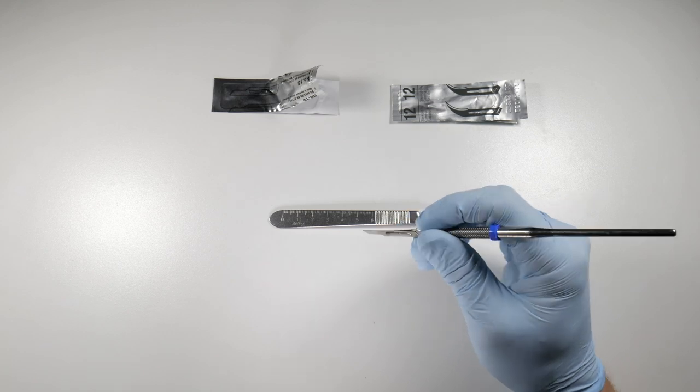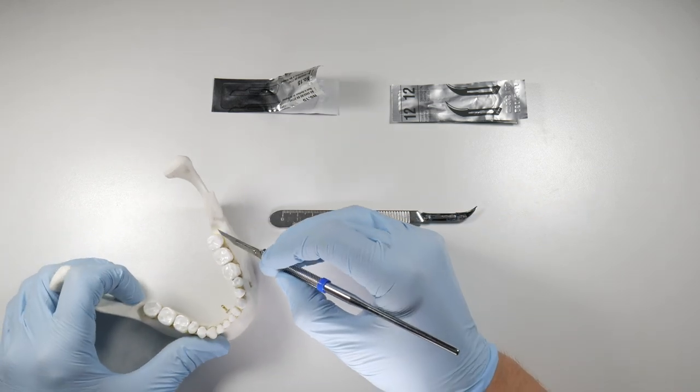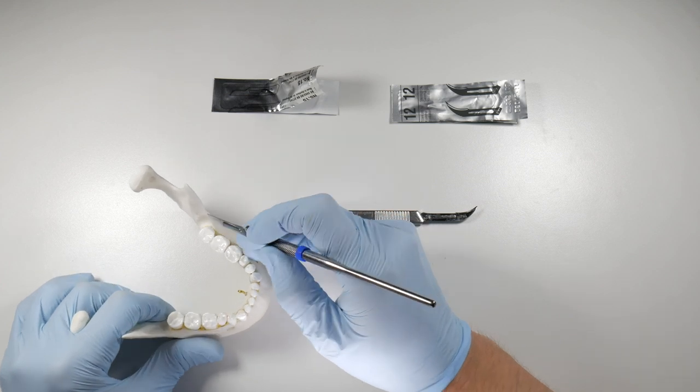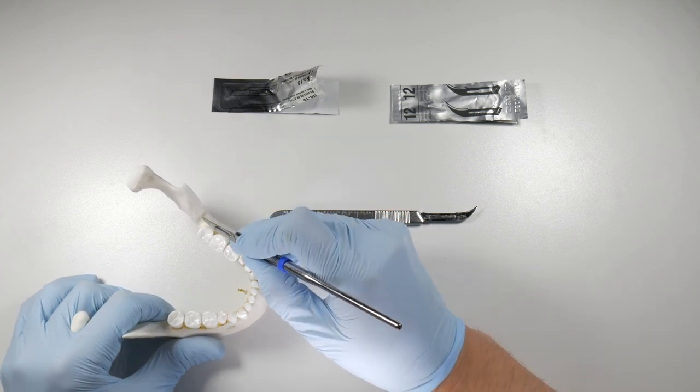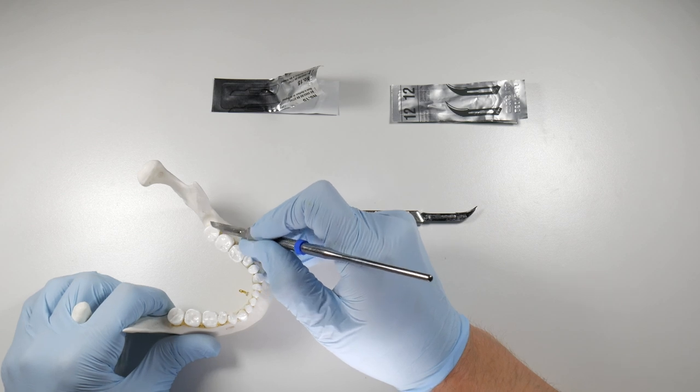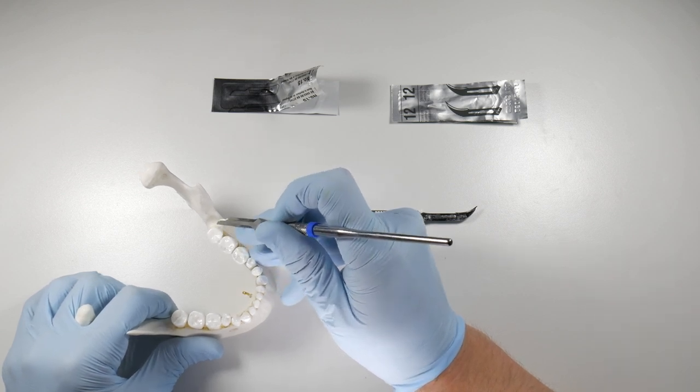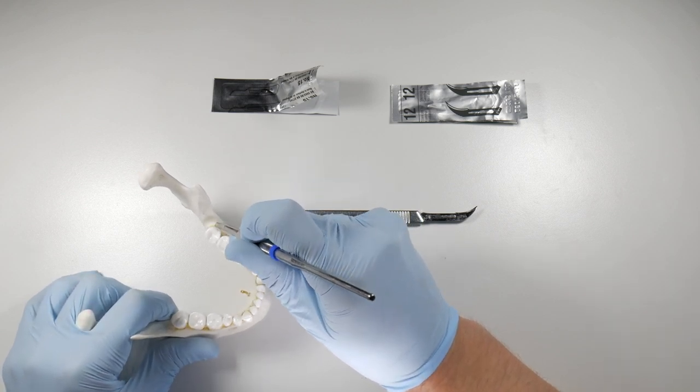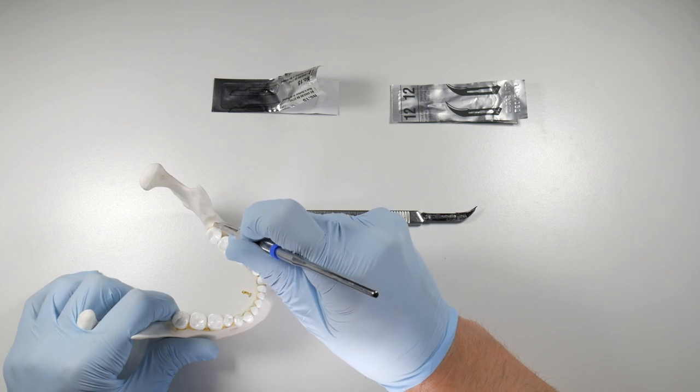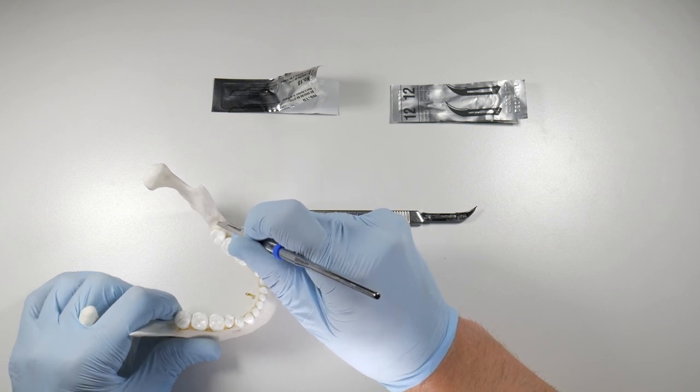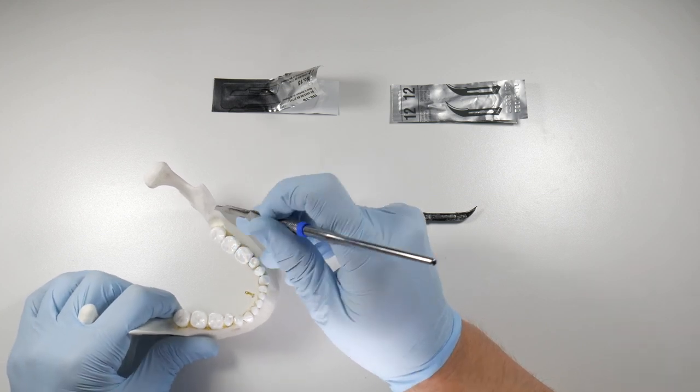The next thing to note would be that when you're making an incision, say with your distal incision on a third molar, you are going to cut from back on that distal buckle all the way to here. Then what you're going to want to do is you're going to want to flip this over and give one more pass just slightly into that incision down at the bone again. That's going to help to release that incision and finish it off.